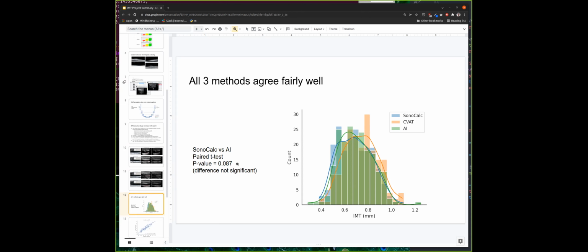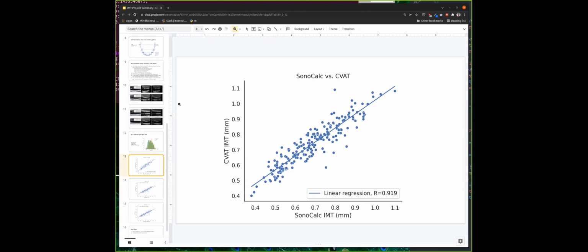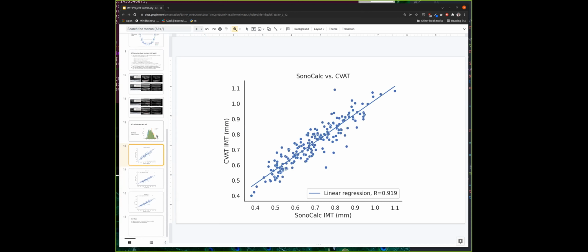Now I know this was a really tiny study, only 200 images here, but I was happy to see that there is very good agreement across them. In general, across a small data set, the CVAT, which is this orange histogram, that the techs tend to draw just a little bit thicker than in the Sonocalc, which is the dark blue. And then the AI was kind of halfway between the two. Nice. And then you could see, yeah, for most of them, there's really good agreement. There's a couple outliers that's interesting to explore, and those usually happened if the image quality wasn't great. It was a really low contrast, and sometimes that was a little hard to get agreement. But overall, I think it's looking really good.